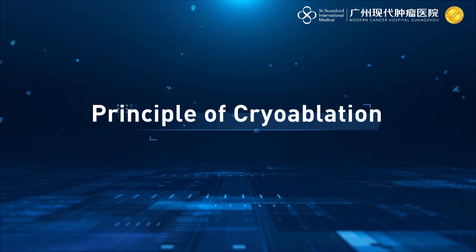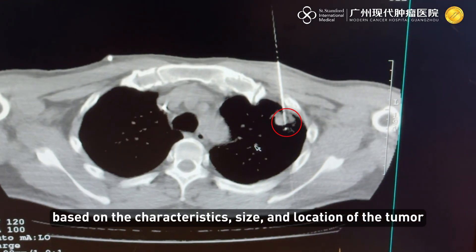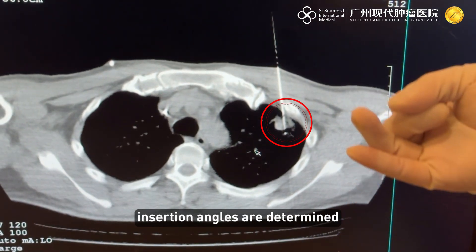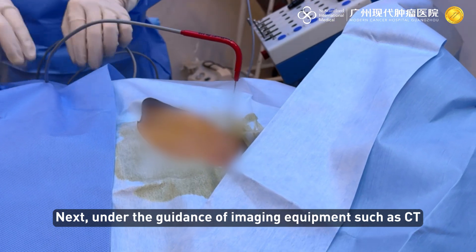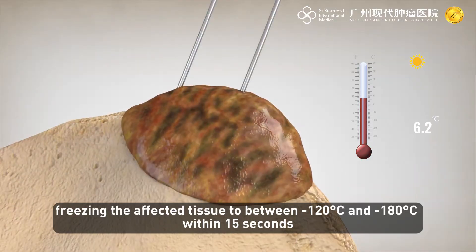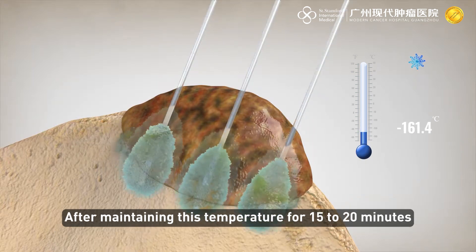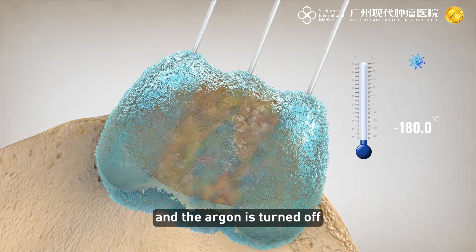First, based on the characteristics, size, and location of the tumor, the number of cryoprobes and insertion angles are determined. Under the guidance of imaging equipment such as CT, a percutaneous puncture is made directly to the tumor. Argon cooling is then initiated, freezing the affected tissue to between minus 120 and minus 180 degrees Celsius within 15 seconds.